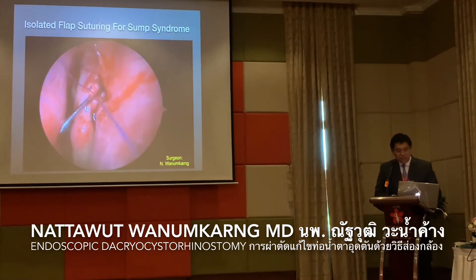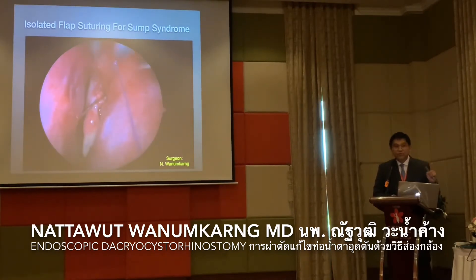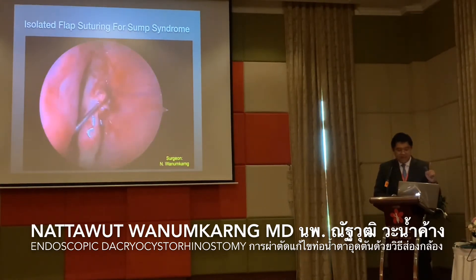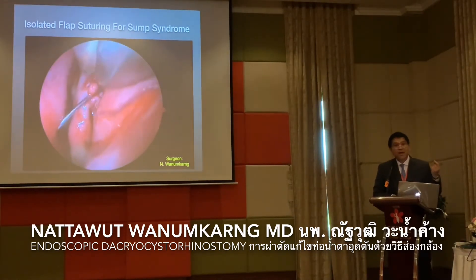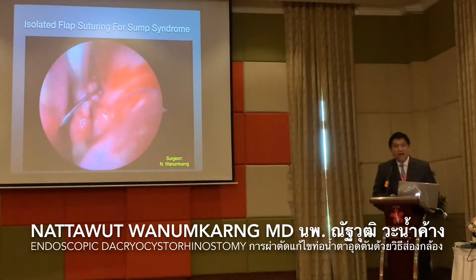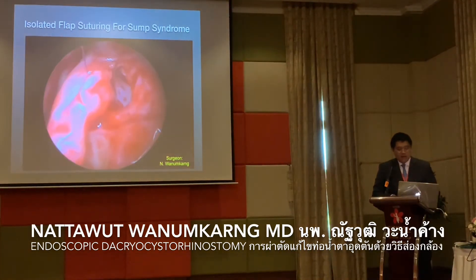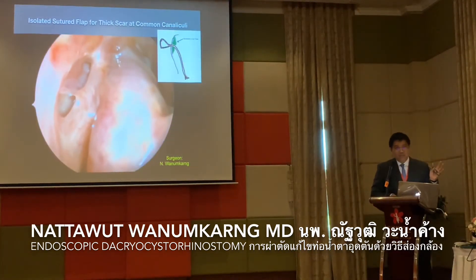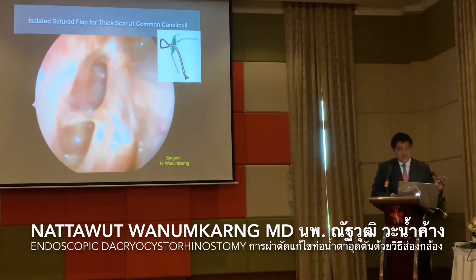For the suturing, only two suture points are enough. The suture will be absorbed by three months and there is no problem at all. It also helps prevent bleeding after the surgery.